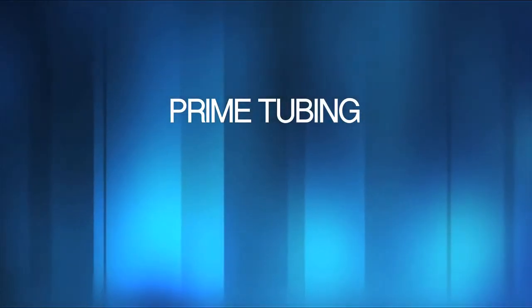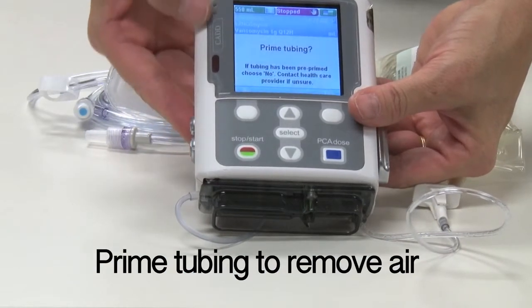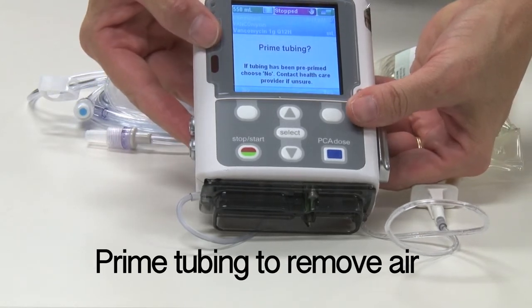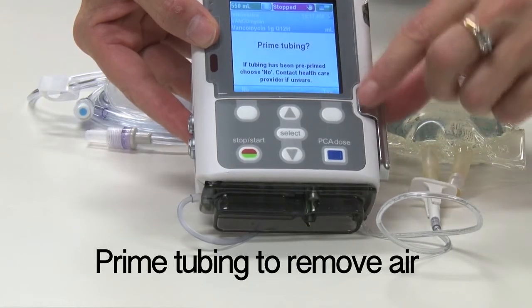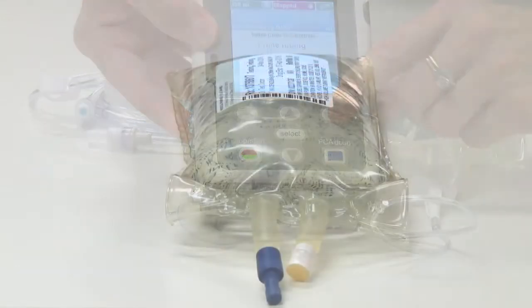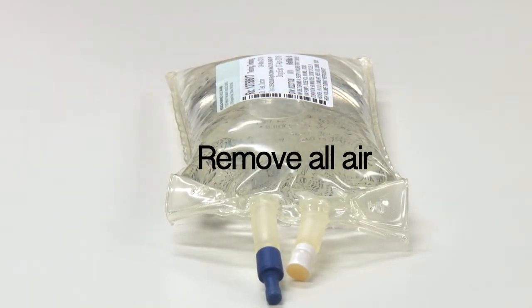It is critical that you remove all air from the fluid pathway in the administration sets to prevent the risk of air embolism. The manufacturer recommends using the priming feature on the pump to prime the tubing rather than priming by gravity, to ensure the filter is primed properly. Remove all air from the IV bag — our pharmacy removes air during compounding of the bag.